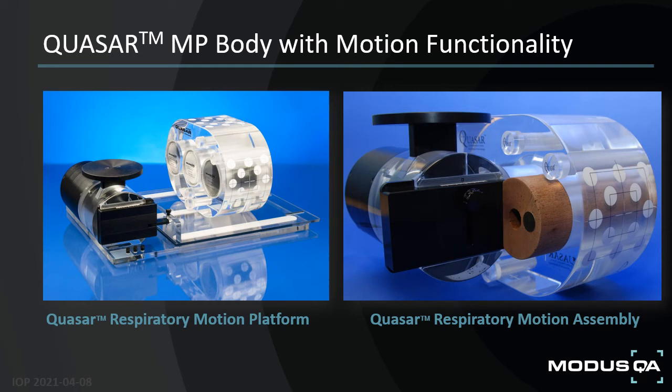By using some type of 4D IGRT method, you can track the tumor motion rather than expanding the clinical target margins, which is a major caveat of the SBRT process.